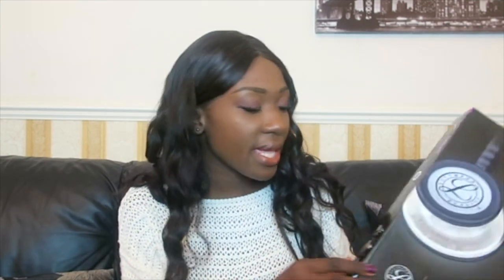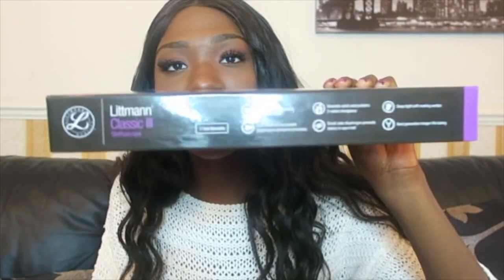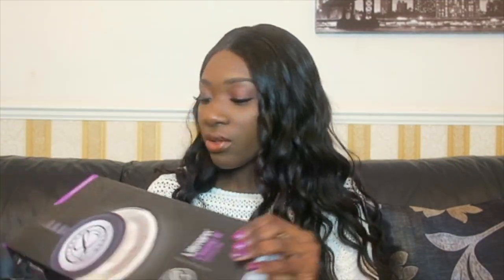It's latex-free, which is very handy in case you have any kind of allergic reaction. Also, what I love about Medisave is they offer a five-year warranty, which is very good — so in case something happens or goes wrong, you're covered. It does say the five-year warranty on the box as well.